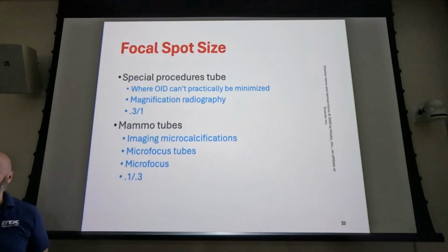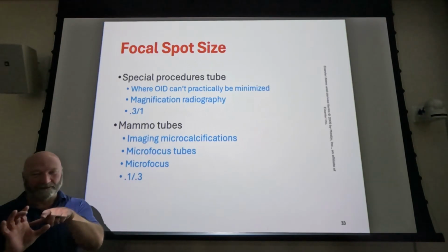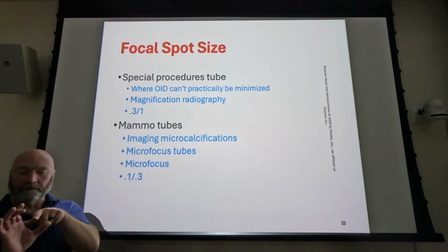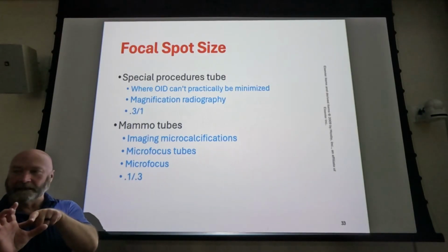Somebody said it, y'all are whispering today. I already talked about it. Chest X-ray, increase SID, right. So you increase SID to overcome that magnification. But what if they did that with a C-arm? You can't really do this with a C-arm, but you've got your anatomy in the middle, so they want to overcome that magnification, so they increase SID.